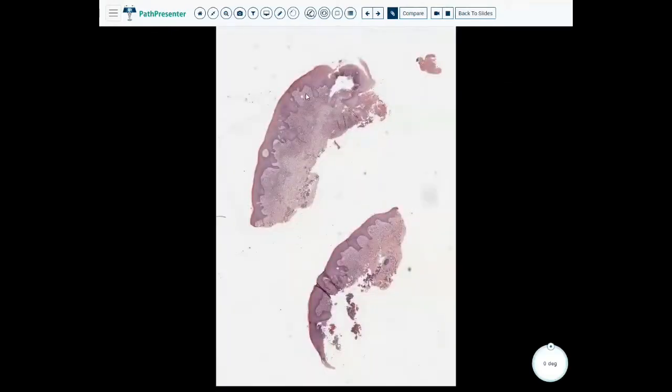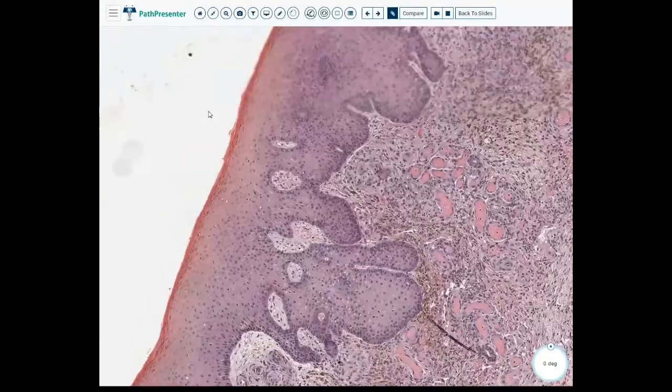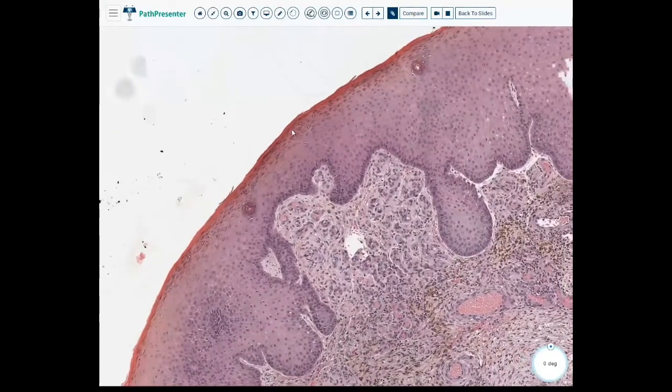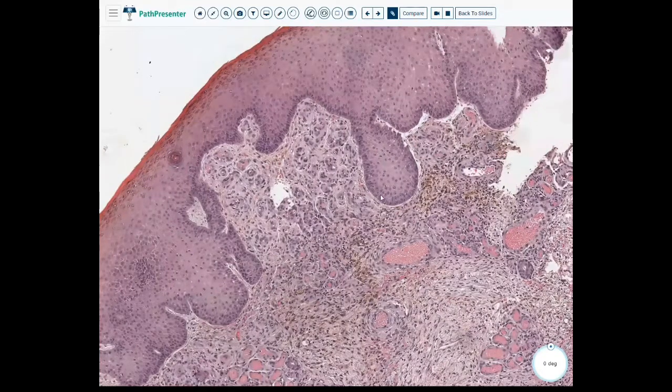Case 1, so what I'm seeing immediately is that there's something going on in the dermis. The epidermis itself looks acanthotic, and acanthosis again means thickened. So if we zoom in a little bit, we notice that the keratin layer seems okay. It doesn't seem like there's a lot going on there. We have this granular layer, which is this pigmented layer on the surface, and our basilar layer looks intact. So that's all good. There's nothing even at mid-power that looks atypical.